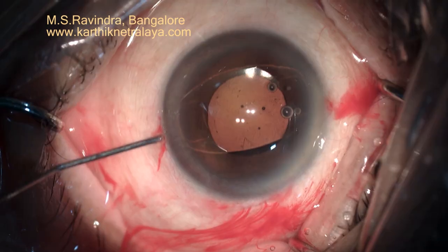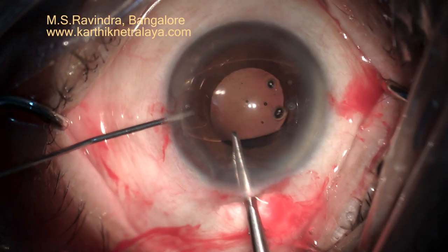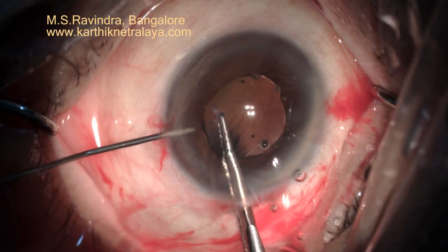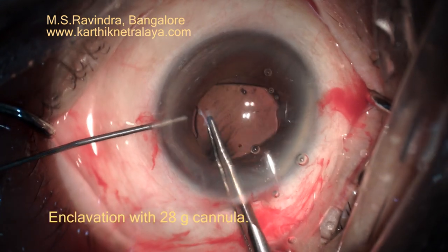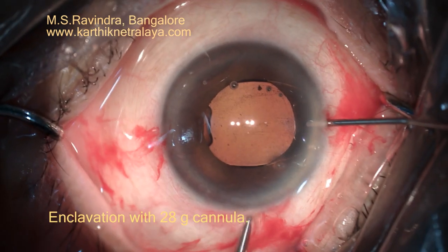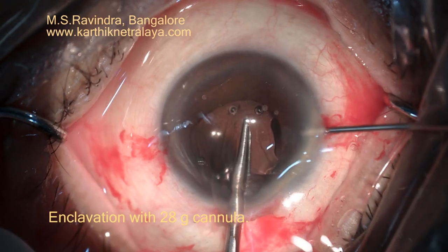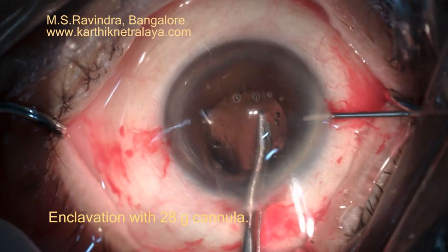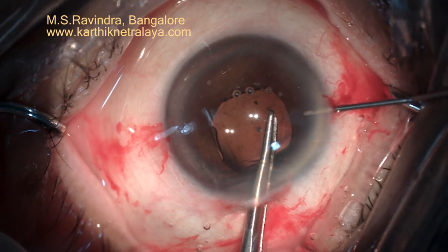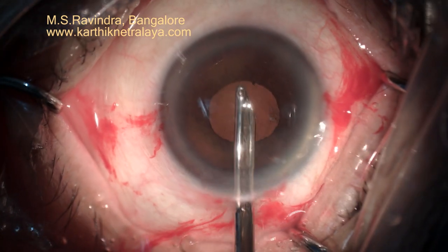The hyaloid phase is intact, there is no vitreous loss. So I could take the lens comfortably behind the iris and enclave using the 28 gauge cannula. I fill the chamber with viscoelastic. It's bound to come out through the open tunnel, but yet we can comfortably enclave the haptic using the 28 gauge cannula. The visco is aspirated completely, including what is stuck on the back of the cornea.